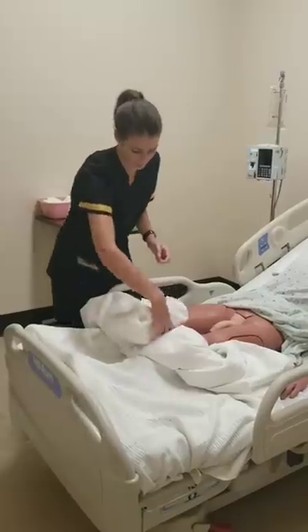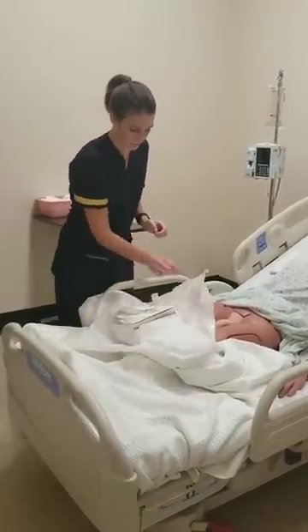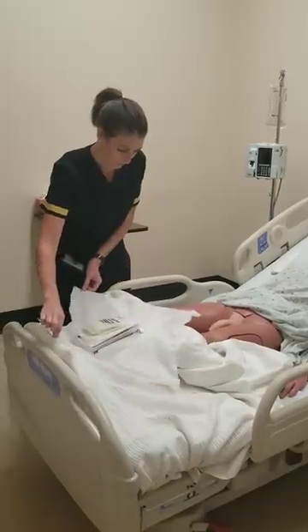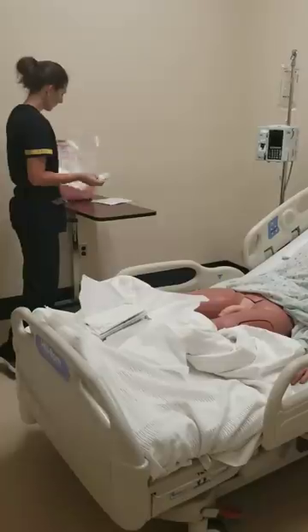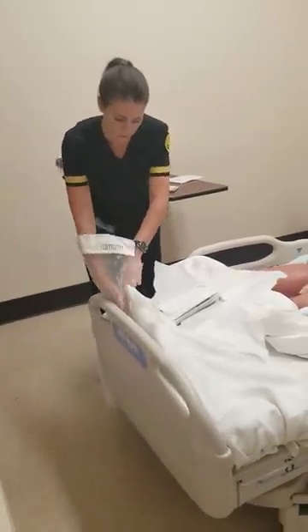So first, I want to open it away from me, side to side, and then back. This is just going to give me a little bit more of a working area. Go ahead and put on my sterile gloves. I'm going to use this as a wash receptacle first.